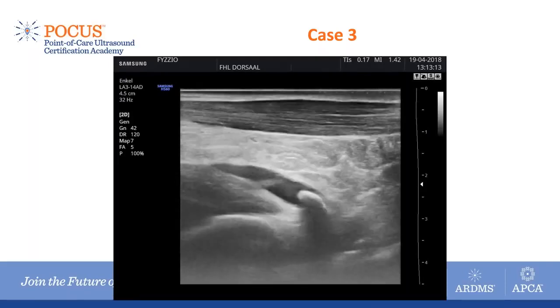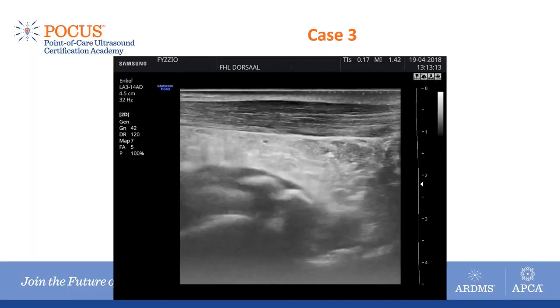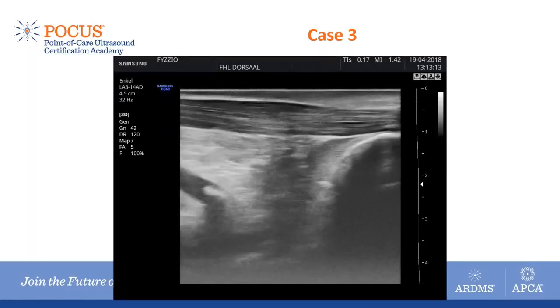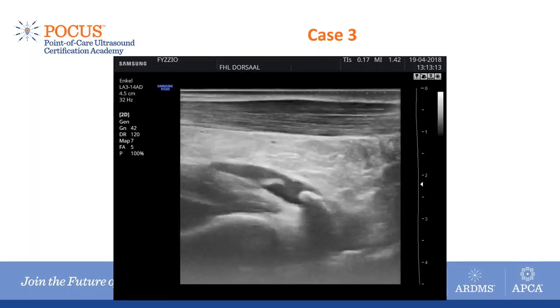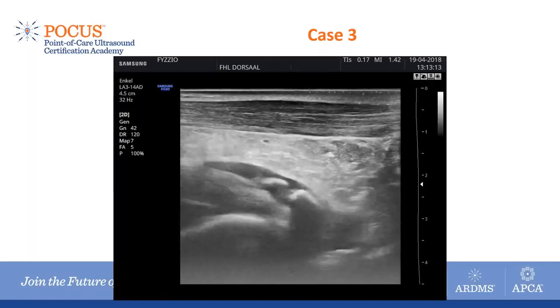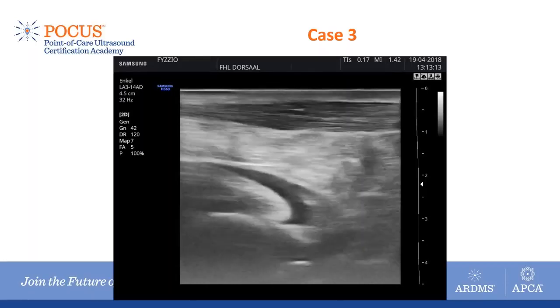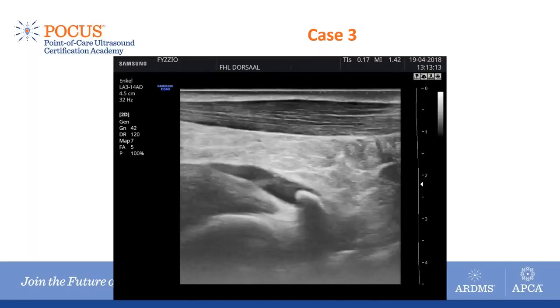On the ultrasound image here, you can see the long axis view of the Achilles tendon with a slight tendinosis, but deep to the tendon and in the Kager's fat pad, there are two hyperechoic structures with acoustic shadowing. They are surrounded by fluid and seem to lie within the flexor hallucis longus tendon sheath. Since they lie within the sheath and the flexor hallucis longus sheath has a connection with the dorsal ankle joint capsule, these are probably loose bodies coming from within the joint.